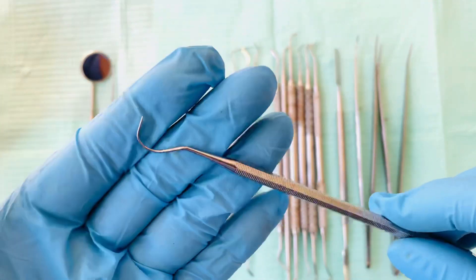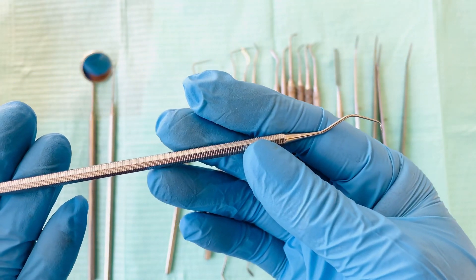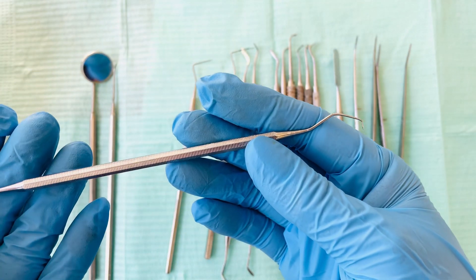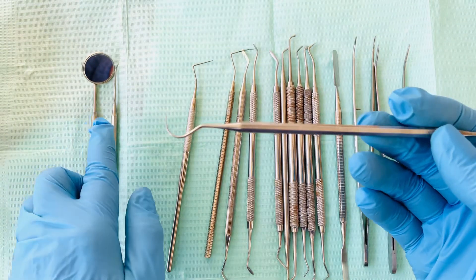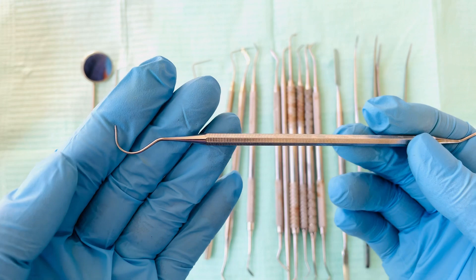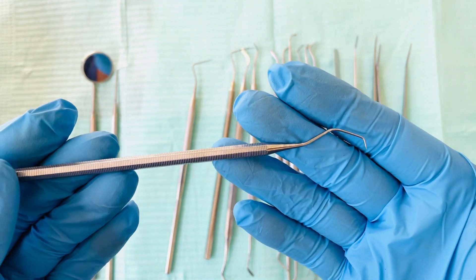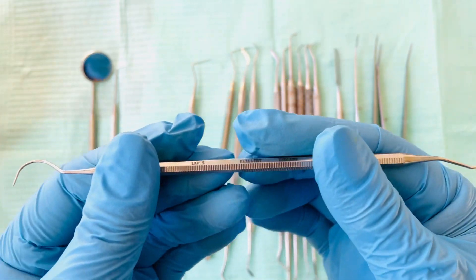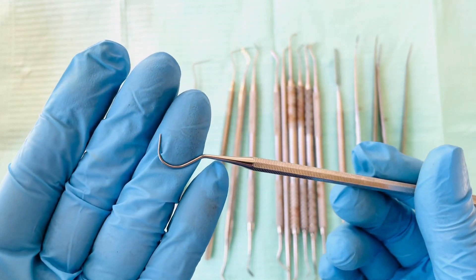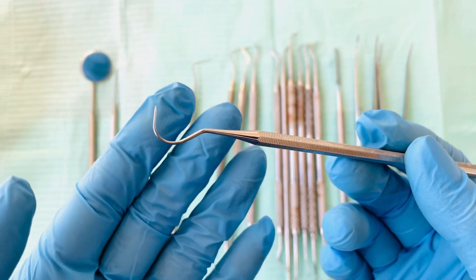Next is the explorer, which I just mentioned. Some clinicians prefer an explorer instead of the straight probe. In different countries they use the explorer and some use the straight probe — it's the same function: to detect or check the surfaces and detect caries on the surfaces of the hard tissue, which is the teeth.